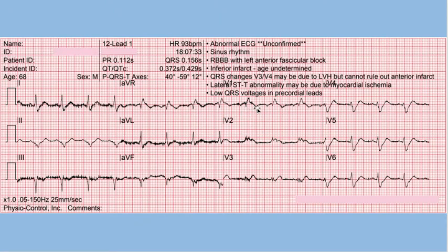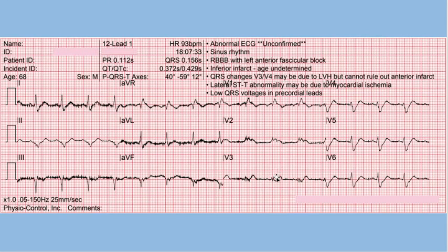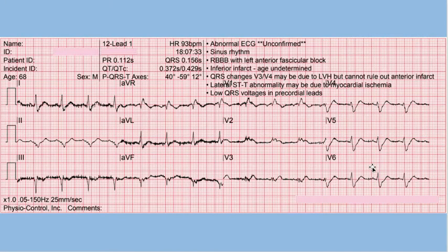Here in the right precordium, isolating the ST segment or J point, you can see that there is elevation at the J point. This goes against everything we said should be expected as a normal variant for right bundle branch block — we should have slight ST segment depression in V1 through V3, but instead we have ever so slight ST segment elevation. Furthermore, there are concordant T waves along with the ST segment elevation, especially in V3. Moving more laterally, the J points in V4 through V6 — which are expected to be at baseline — are demonstrably depressed.